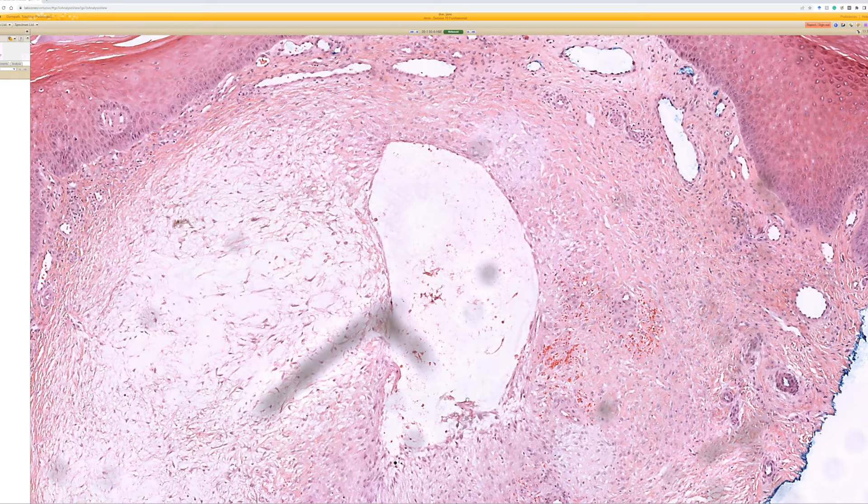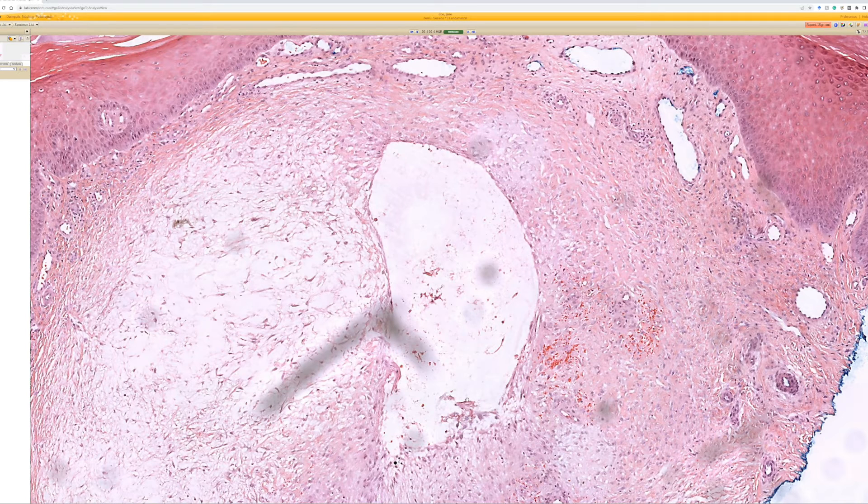But do note that sometimes, depending on tissue processing, sometimes once you cut into it, all the mucin falls out and it washes away during processing. And you do get a just empty clear space. So it can either be an empty white or clear space, or it can be filled with bluish stuff and debris.